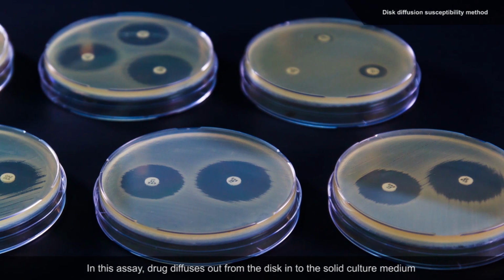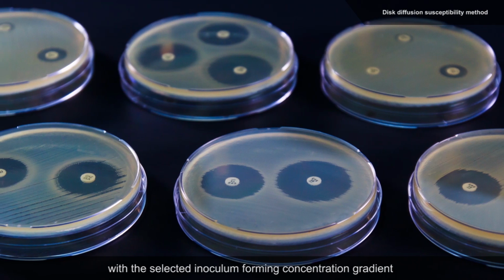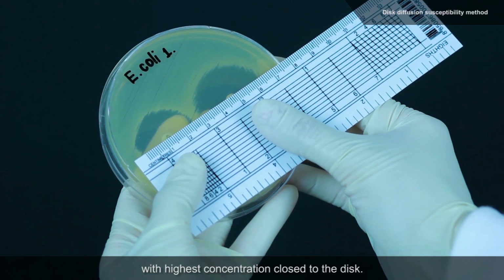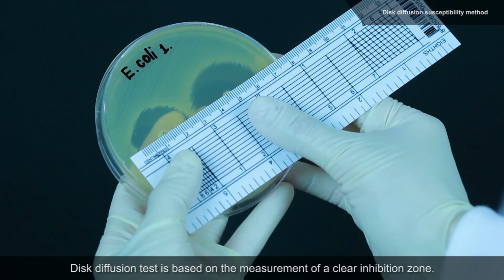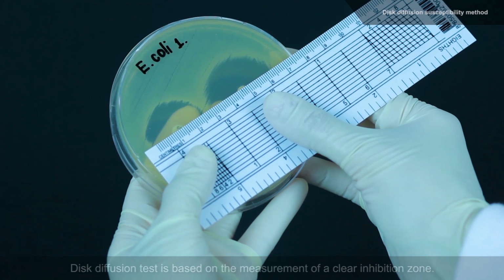In this assay, drug diffuses out from the disc into the solid culture medium with the selected inoculum, forming a concentration gradient with highest concentration close to the disc. Disc diffusion test is based on the measurement of a clear inhibition zone.